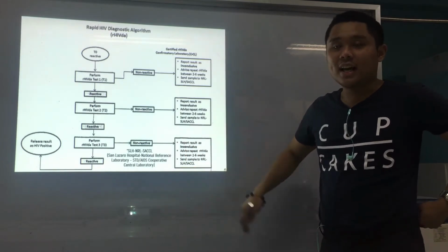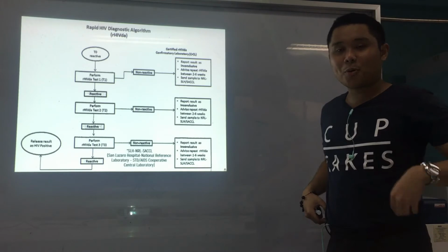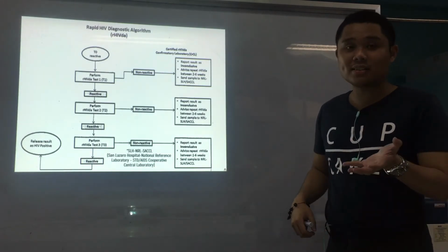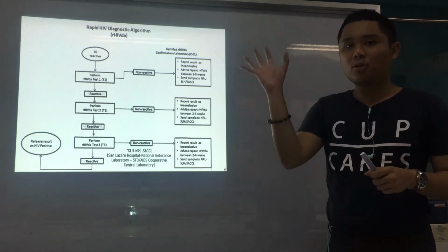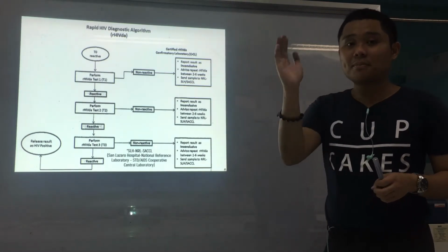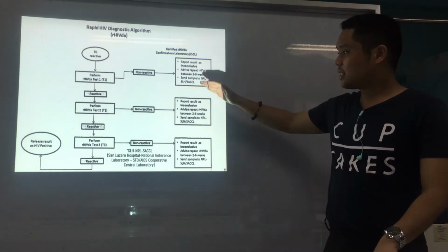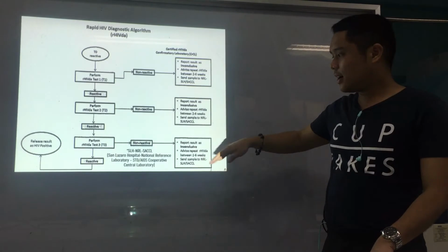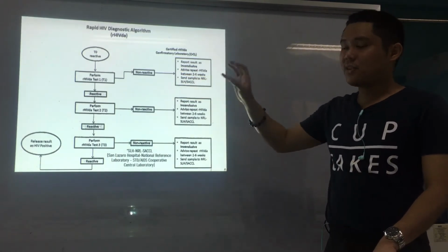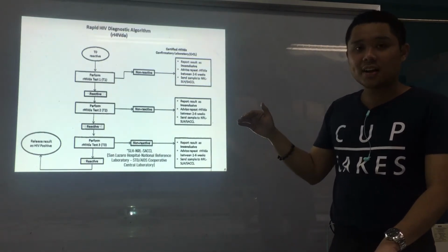So that's for AIDS. HIV is in SACL. San Lazaro Hospital, STD AIDS Cooperative Central Laboratory. Yes, National Reference Laboratory. So it's a reference laboratory in the Philippines. So all samples, to confirm if it's still HIV positive or not, are submitted to SACL or to San Lazaro Hospital. Okay, so the outcomes are the same if you are non-reactive in each of the RHIVDA tests. Okay? In your different RHIVDA tests.